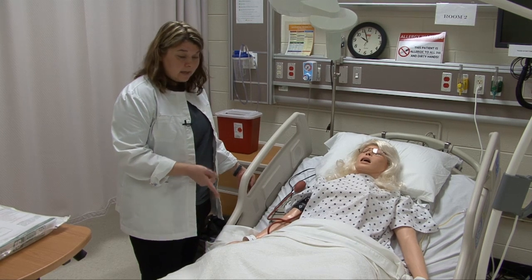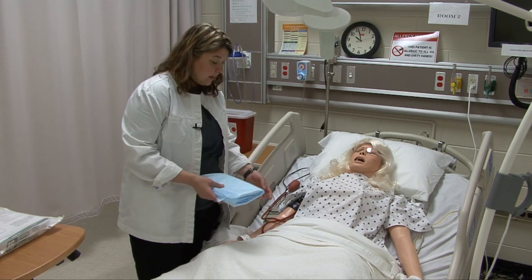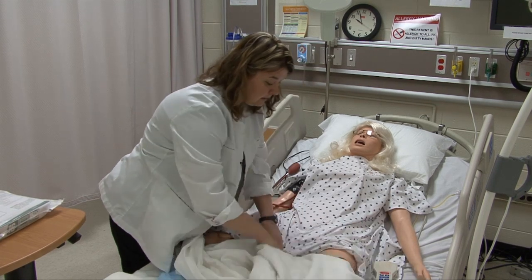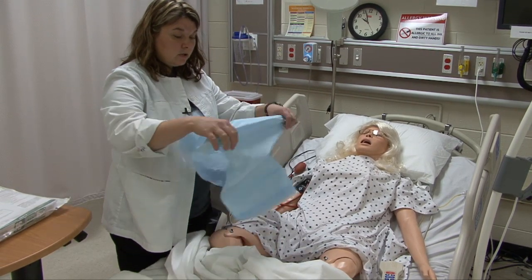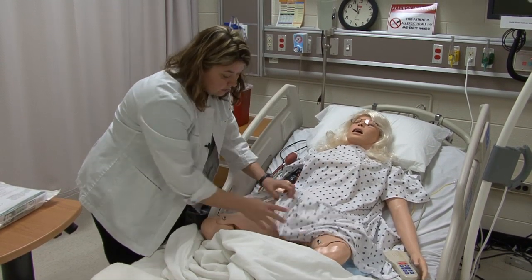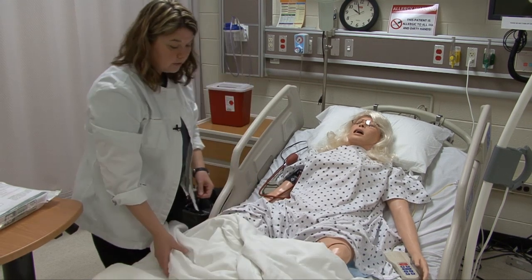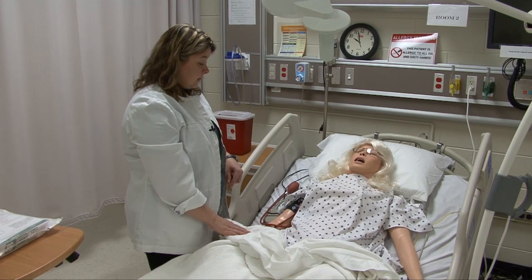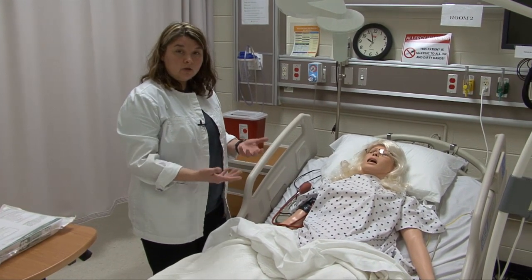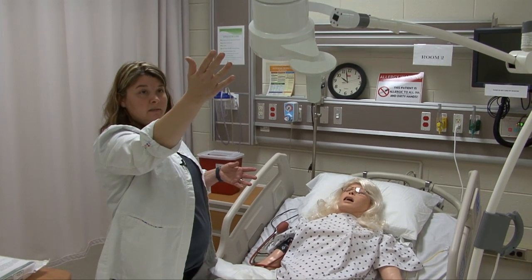I'm going to put a pad down underneath her. I've got some waterproof pads, or you can use cloth chucks. I'll need to uncover her for a minute. Slide the pad underneath her hips — usually if you get your patient to raise their hips, they can help. Make sure it's underneath the perineal area enough so that when you have drainage it catches anything during the procedure. I also have my alternate light source in place. Make sure it doesn't get in your area or fall on your patient.